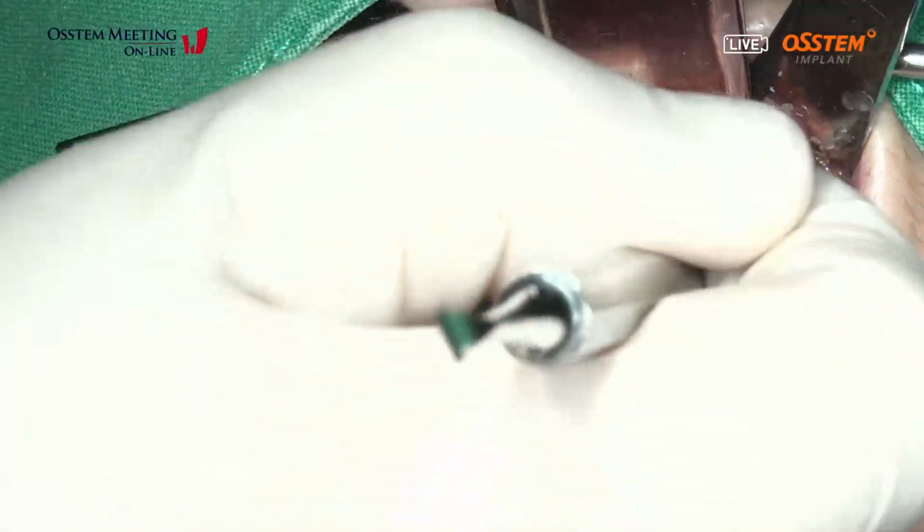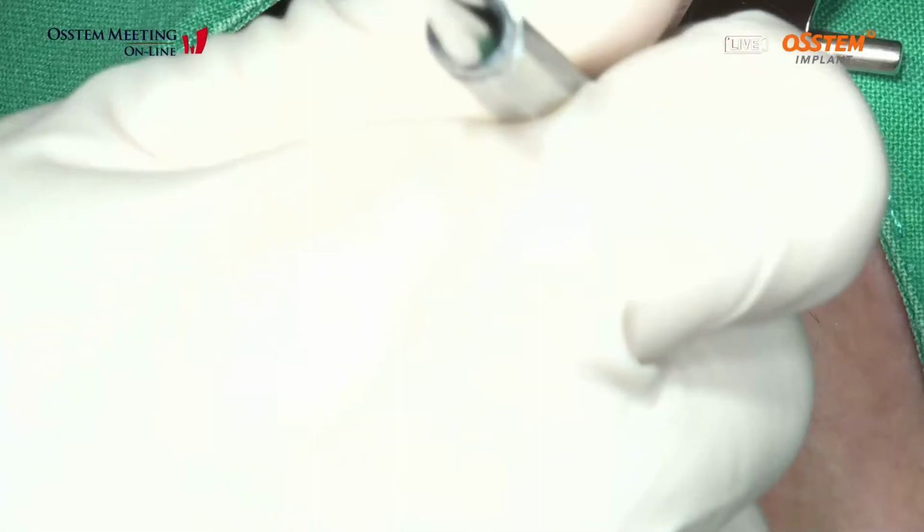So I will elevate the flap from the left side.